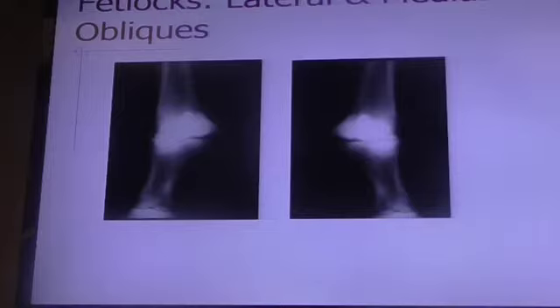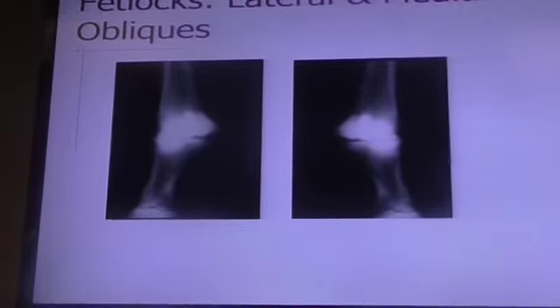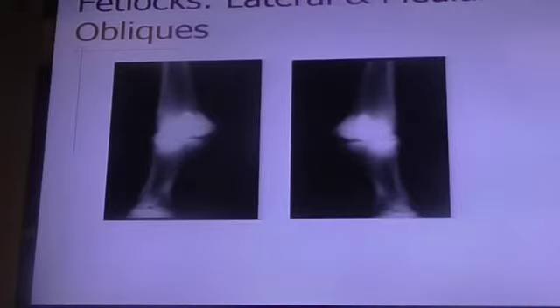Okay, you equine people better get this right. I put lateral. I can't keep this thing straight. I don't know. I'm really confused. Okay, you want this more time?